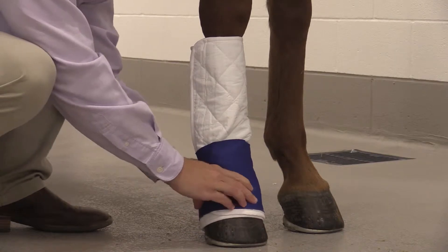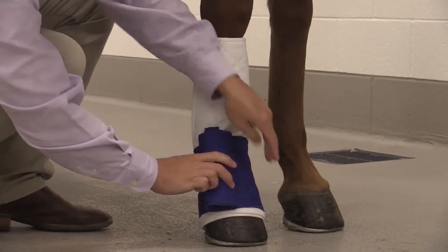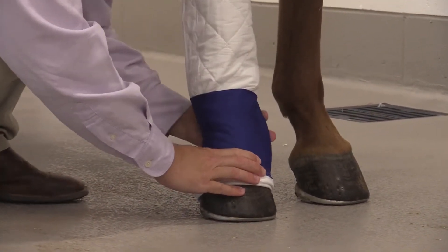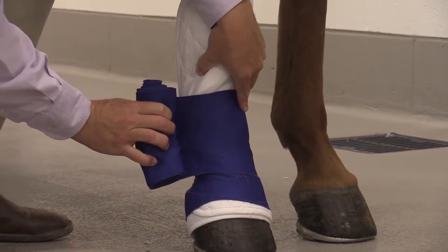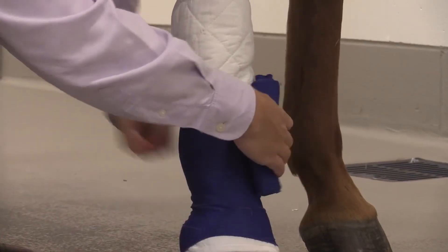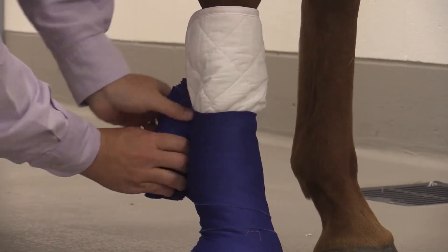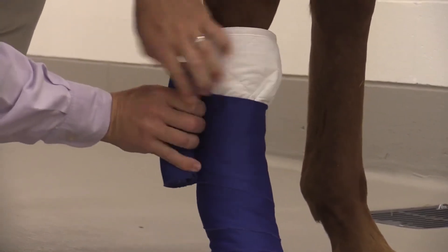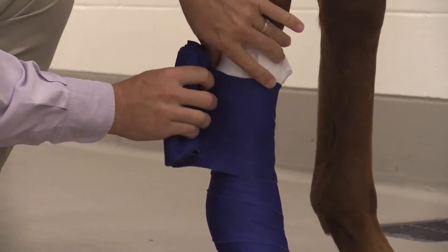We'll start at the distal end and allow a little bit of that quilt to show at the very bottom. Then we're going to snug this polo wrap to mold, contour, and support the leg. Pulling this polo wrap fairly snug will allow for support and prevent the bandage from becoming too loose or turning during application.